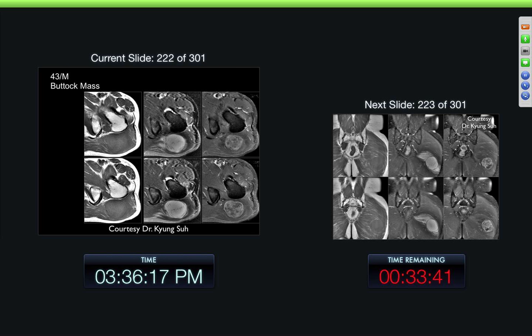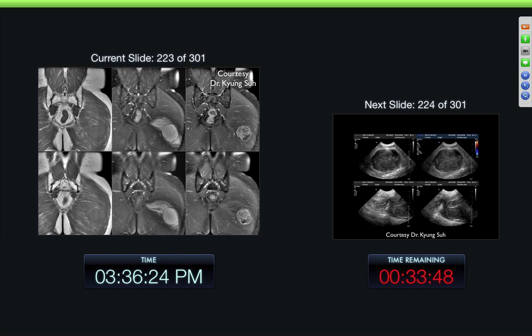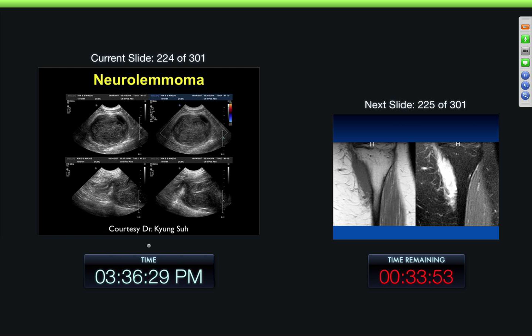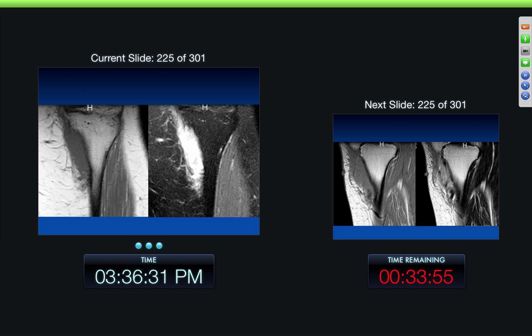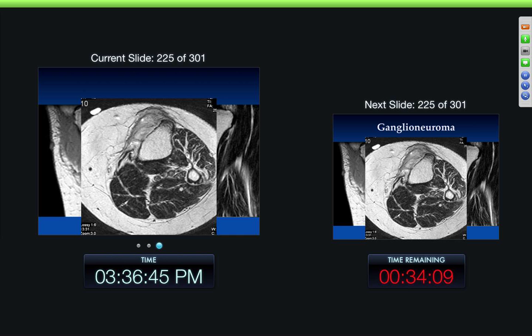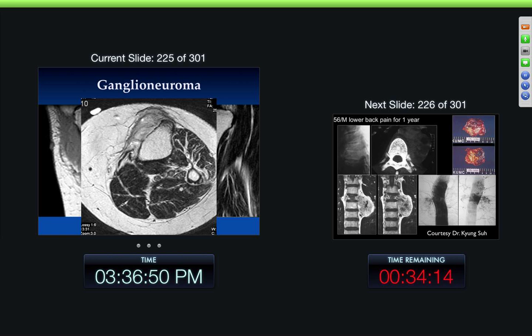43-year-old male with a large buttock mass — this was a neurolemmoma. Here's a mass along the tibia — much more inhomogeneous, margins much less distinct than the other tumors we've just been seeing. Almost a little bit like it's infiltrative into the subcutaneous fat. And this was a ganglioneuroma. It was benign, but it had a more aggressive growth pattern than most peripheral nerve sheath tumors.